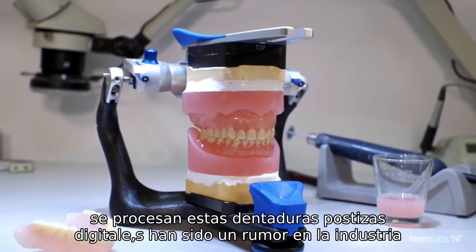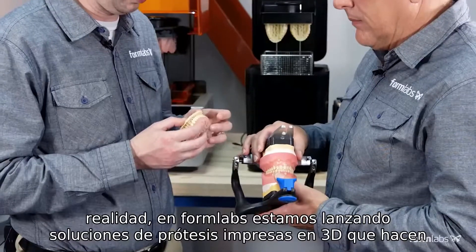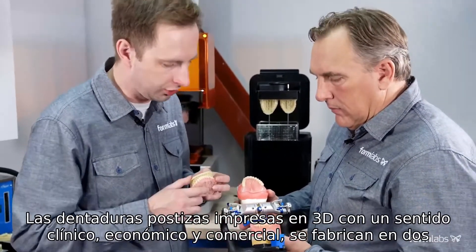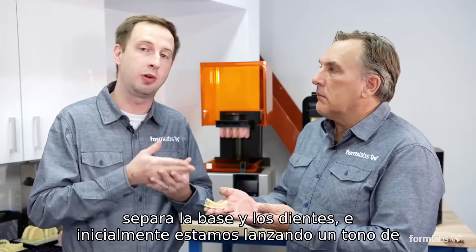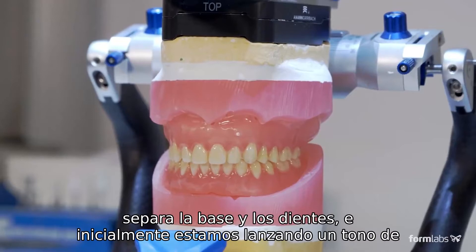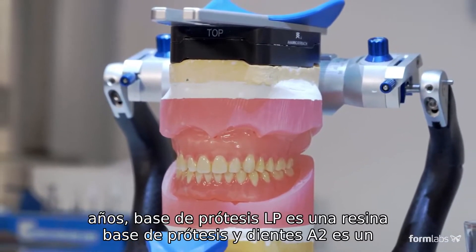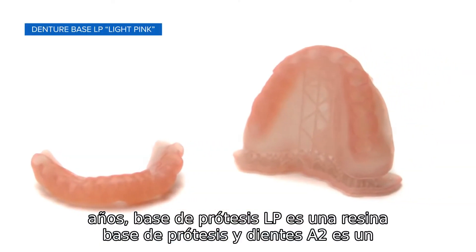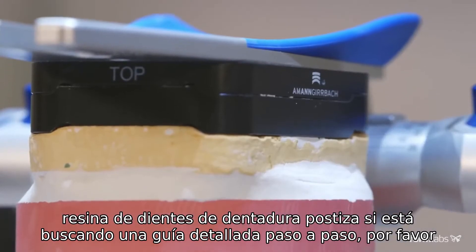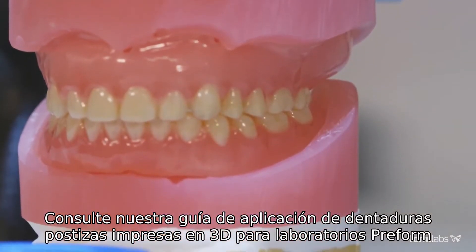Digital dentures have been the buzz in the dental industry for a few years now, and we're excited that it's actually becoming reality. At Formlabs, we're launching 3D printed denture solutions that make clinical, economical, and business sense. 3D printed dentures are made in two parts — the base and the teeth — and initially we're launching one shade of each, with plans to have many shades released in the upcoming year. Denture Base LP is a denture base resin, and Denture Teeth A2 is a denture teeth resin. If you are looking for a detailed step-by-step guide, please refer to our 3D printed denture application guide.